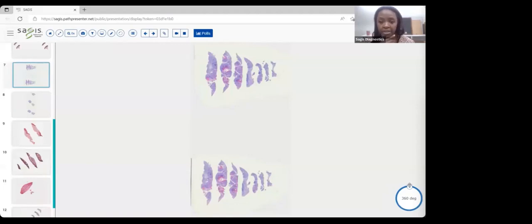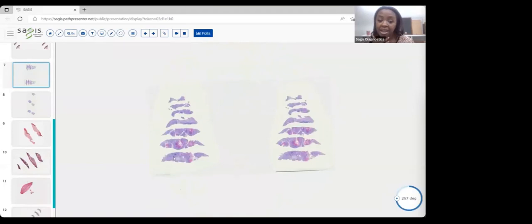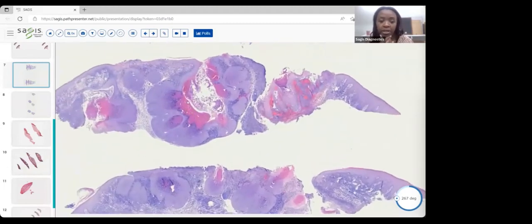Okay, and then the second consideration for molluscum is that, as we know, these lesions can be self-limiting, right? They can regress. And it can be a little tricky diagnosing molluscum from a regressing lesion. You may not see those wonderful Henderson-Patterson bodies, so we call them, right? These enlarged keratinocytes, we may not see them so clearly. We may have to kind of hunt for them, but hunt for them we should.